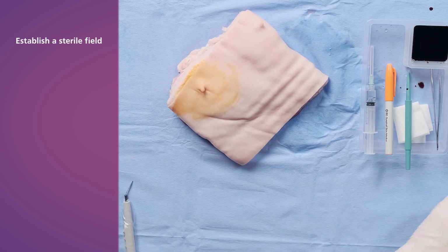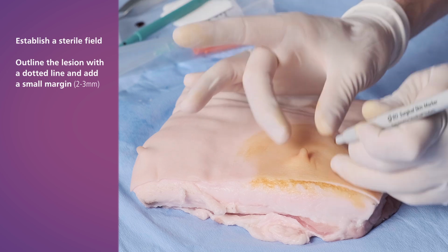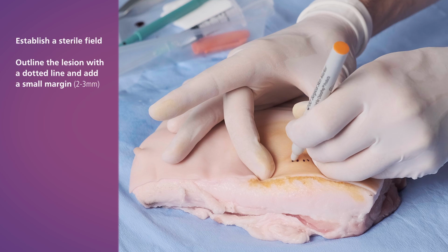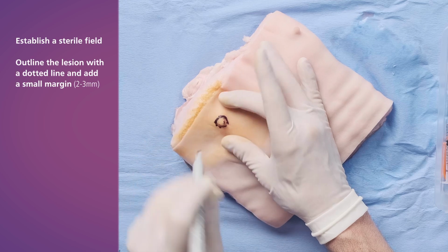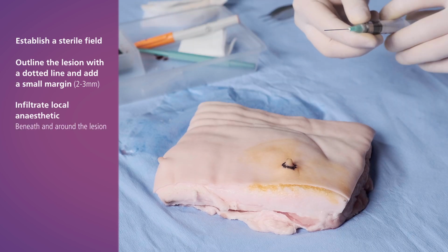Using a surgical skin marker, outline the lesion with a dotted line, and if needed, add a small clinical margin of normal skin to ensure adequate removal of the lesion. The margin is usually 2 to 3 mm depending on the clinical diagnosis. Infiltrate local anaesthetic beneath and around the lesion.